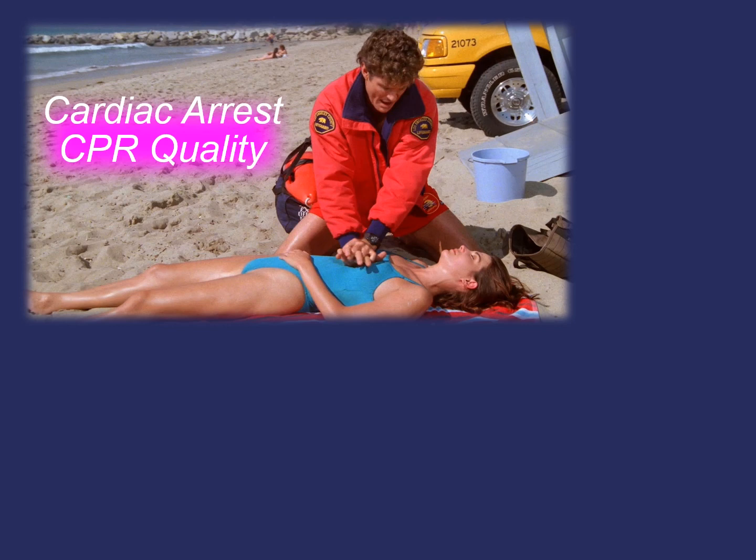So first, let's talk about the rundown of the most obvious use of capnography we are all used to, cardiac arrest. We are measuring our resuscitative efforts as well as observing for ROSC, which is cardiac output and pulmonary blood flow. The better the end tidal levels measured during chest compressions, the better the cardiac output.